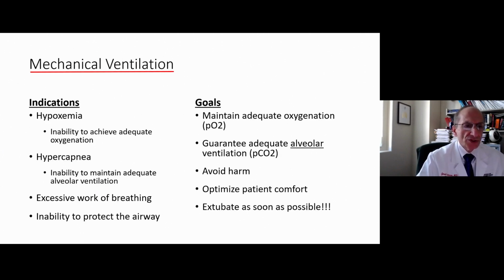So let's talk first about the very basics of why we mechanically ventilate anybody in the first place. I think this topic is very difficult for people who don't manage ventilators routinely, so I really am coming back to the basics on this. We manage patients on mechanical ventilation for really only a few reasons. One is that they're hypoxic. They need simply a greater delivery of supplemental oxygen than they can get otherwise. Hypercapnia, of course, that is, they can't ventilate. They can't blow down their PCO2 to manage their pH.